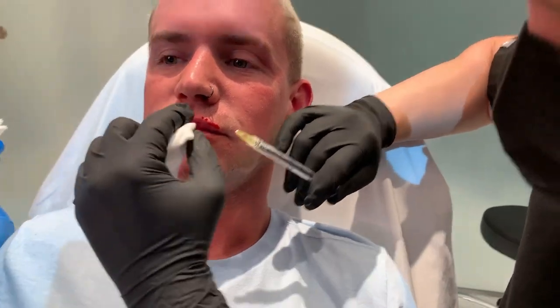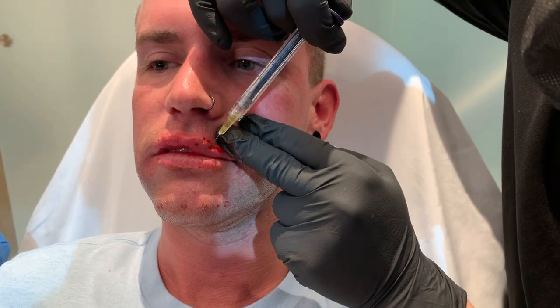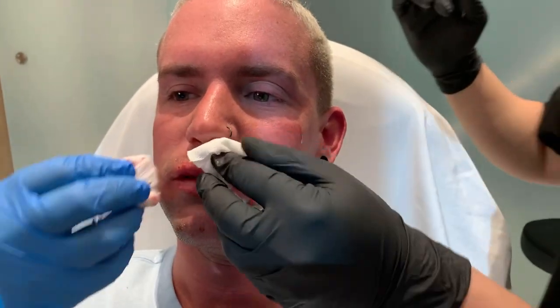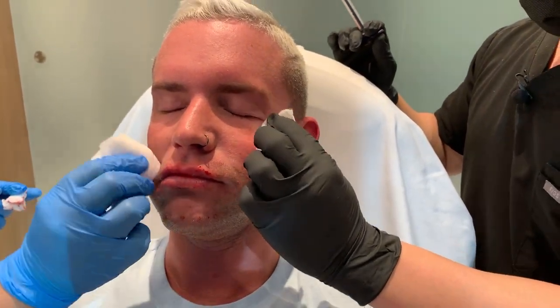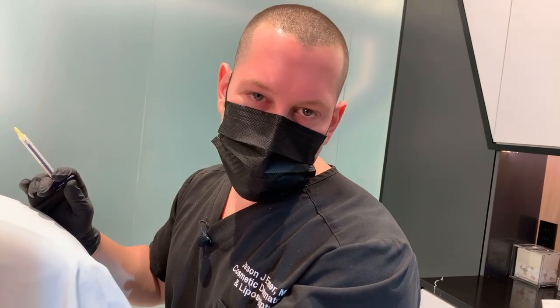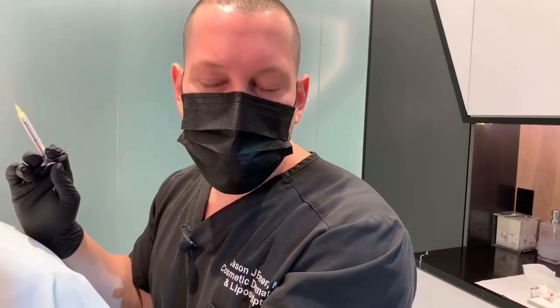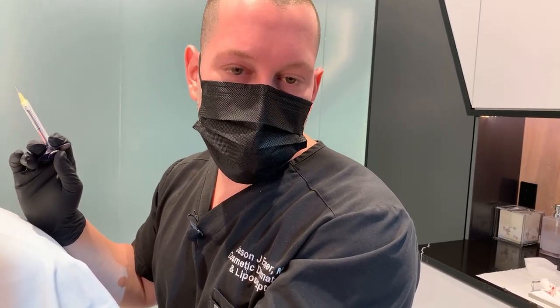Again, trying to get the top part to kind of curl up a little bit using a pillar technique. He'll probably want to do a little more. Close again, close. How long does lip filler last? This will last him about a year. Most often guys tend to about 9 months, want a little bit more. I usually think, especially in someone like him where we literally had almost no filler, then he might want to leave him a little bit more in a month or so if he needs more, and then you go every year sort of thing. Let's take a look now.